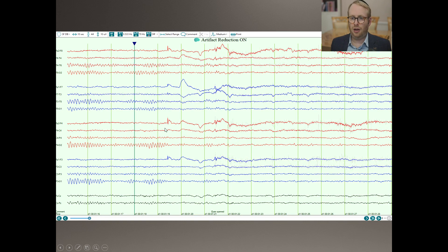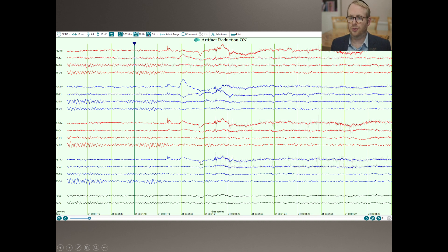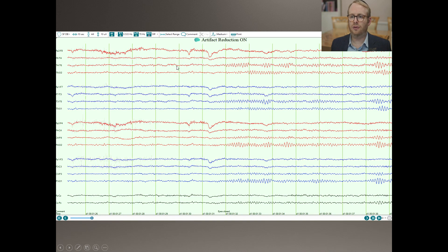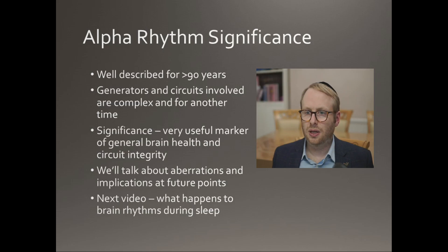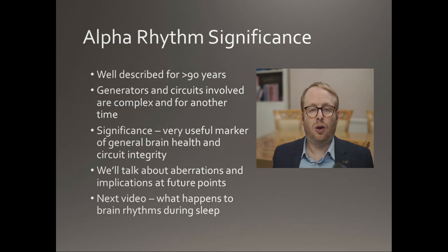Over here I've asked the person to open their eyes, and you can see that this alpha activity has now attenuated down — you can almost not see it. And if we go to the next page, when they've now closed their eyes, it reappears and has its nice spindly formation once again. So that's the alpha rhythm.